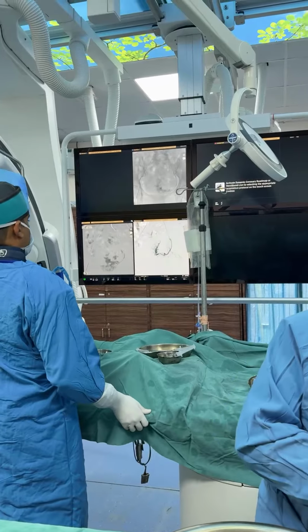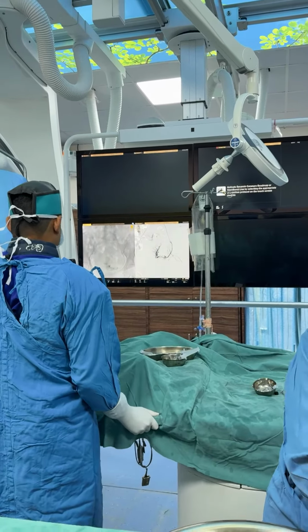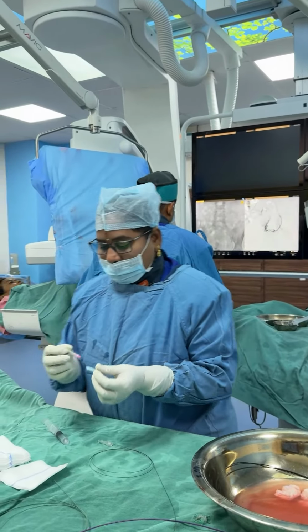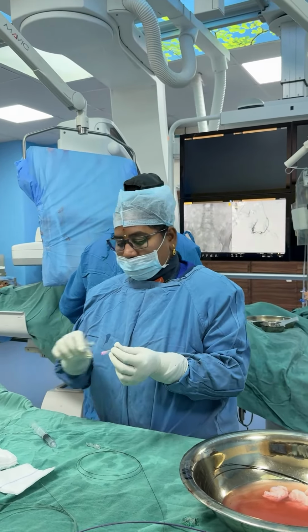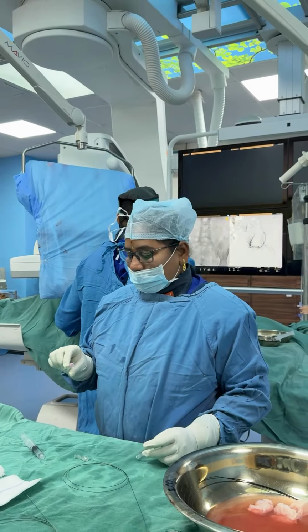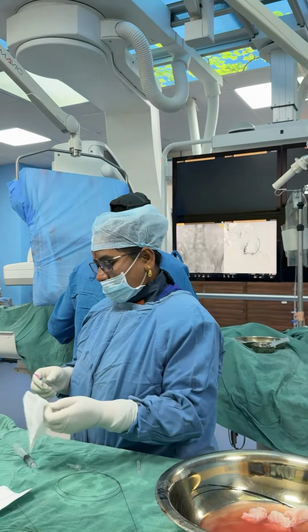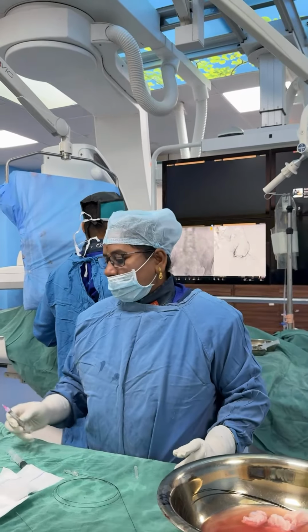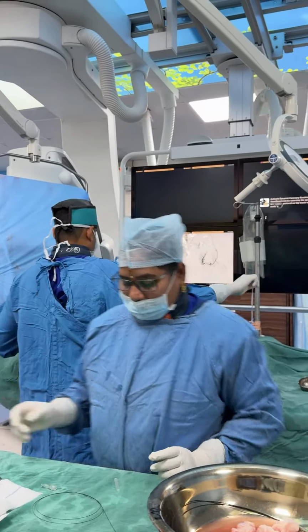Roadmap out. Not needed. We have already got a good result.